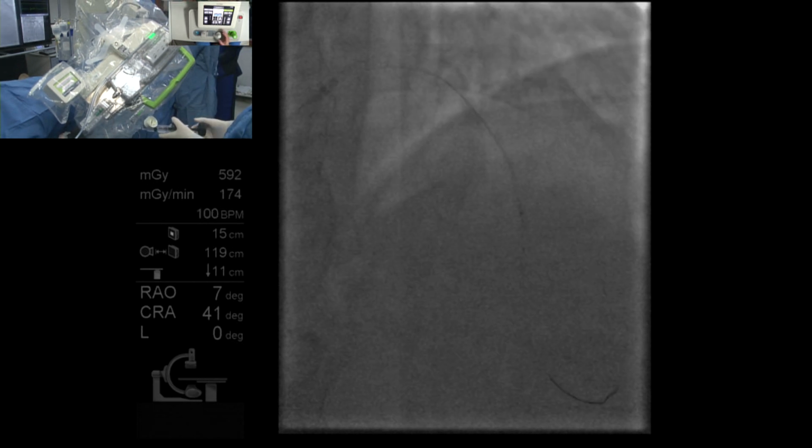Okay, and I'll take that balloon up there, please. 246, yep, 246. Okay, balloon down. It kind of watermelon seated forward. Okay, so we'll pull the balloon back half a balloon length.